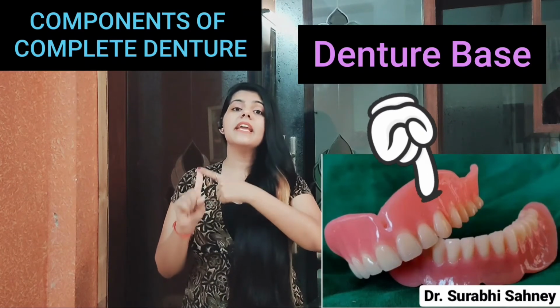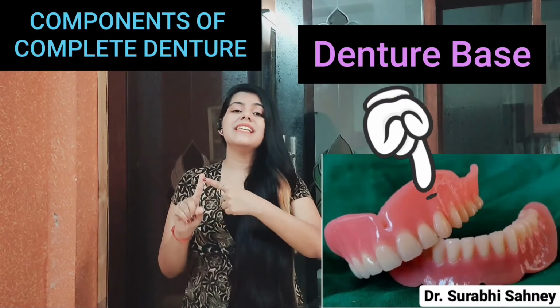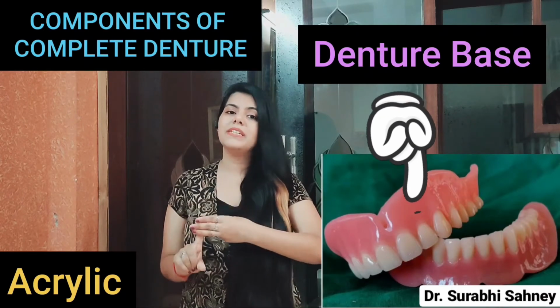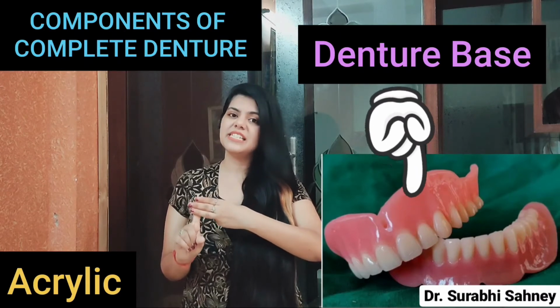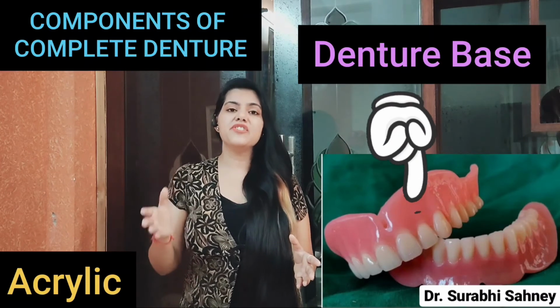base, that is the acrylic resin denture base. First, it is easy to fabricate, economical, and it is the most commonly used form of denture base which we use in our day-to-day life. Begin with the advantages of the acrylic denture base.